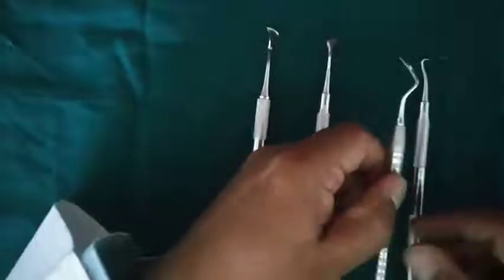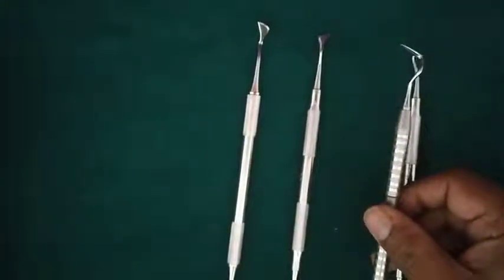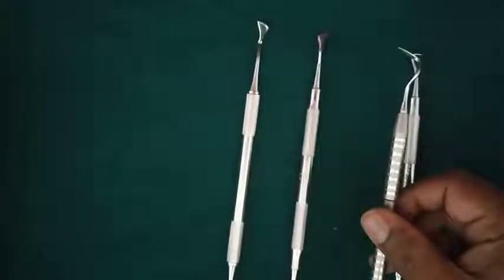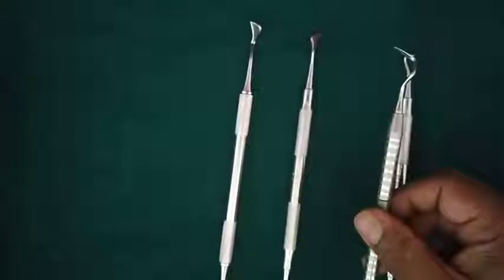The next is Orban's Interdental knife. The Orban's Interdental knife is used to give the third incision in periodontal flap surgery — that is the interdental incision — and it is also used to remove the interdental tissue in the gingivectomy procedure.